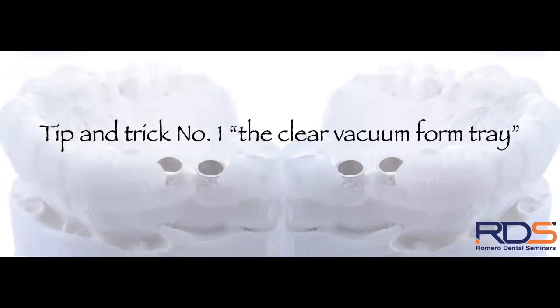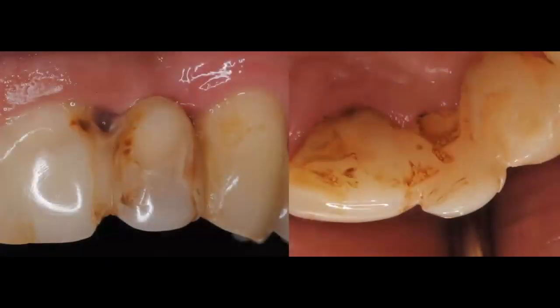So let's get started with our tip and trick number 1. Let's look at the clear vacuum form tray. As you know, if you've been part of our webinars before, our webinars are normally very clinical. So I'm going to share with you today this first case. And what I want you to see here is the way that we received our patient.